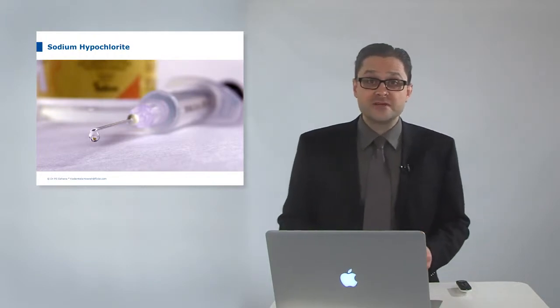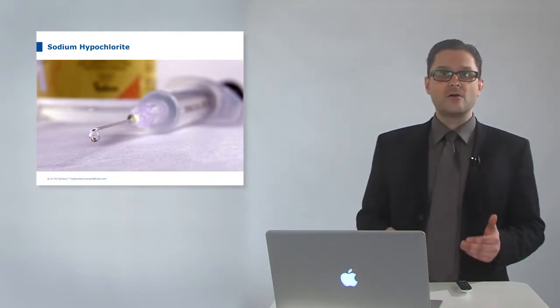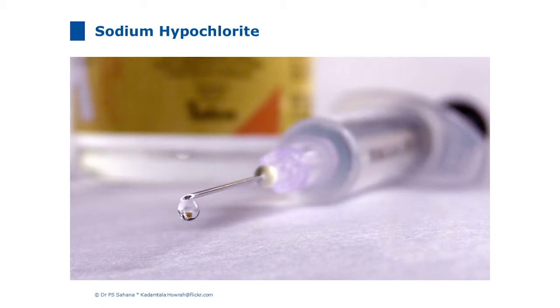The next step is the disinfection and the organic dissolution. Sodium hypochlorite is used for that. You do the treatment in a sodium hypochlorite swimming pool. First, you fill the sealed inner tooth and the root canals as far as possible with the aggressive disinfection solution.